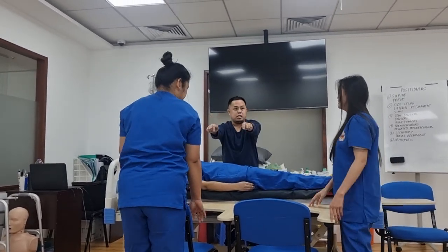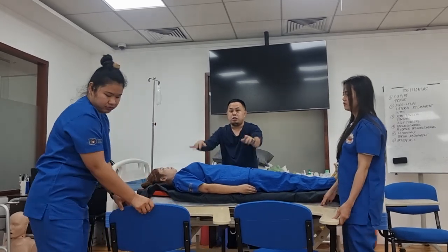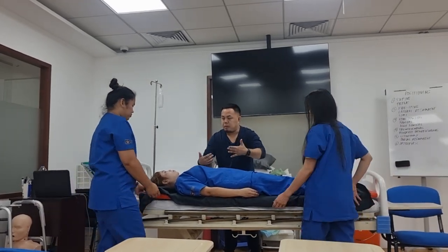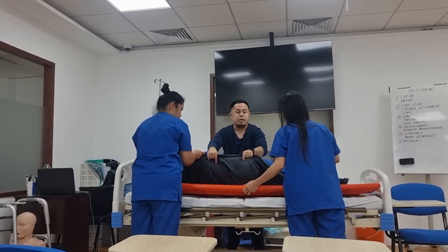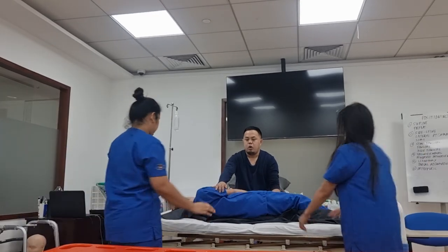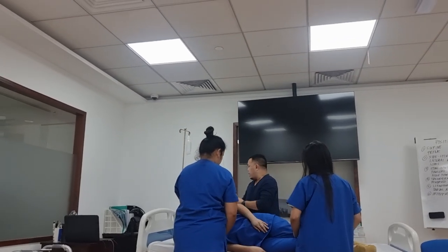She's now on the stretcher bed. Once on the stretcher bed, ask your colleague: 'Can you help me roll the patient towards me?' Then remove the board and put it to the side. Ask your colleague to help hold the patient and roll the patient towards you so you can remove the slider sheet from the other side.